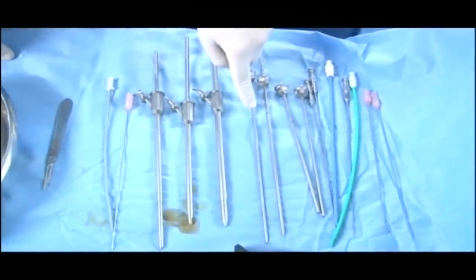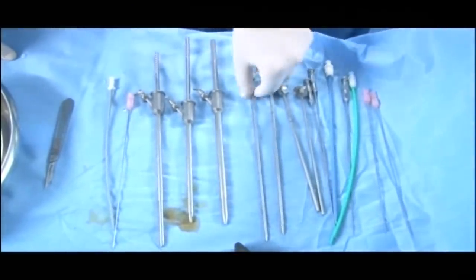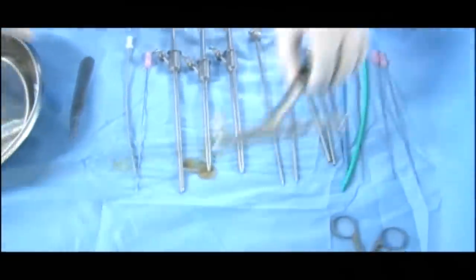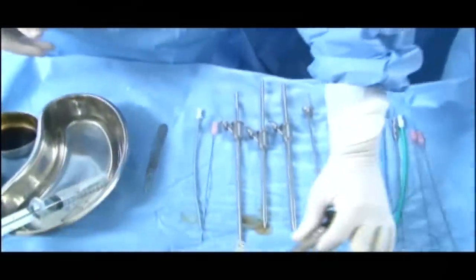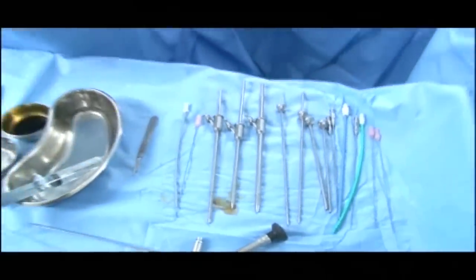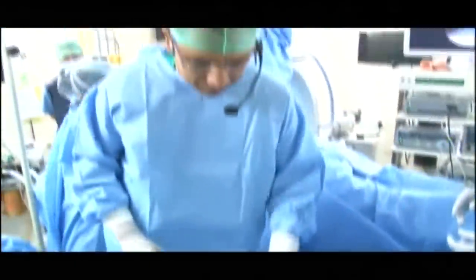There is a 7.5 French scope which is designed by the Galstros which goes to this, and there is a 12 French scope which goes to the regular mini PCNL. So this is all about the equipment and now we will proceed with the puncture. Any questions on the equipment, please?